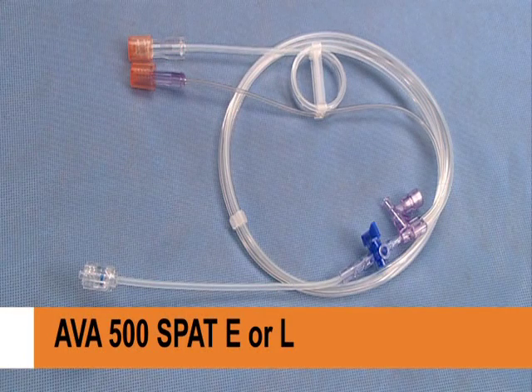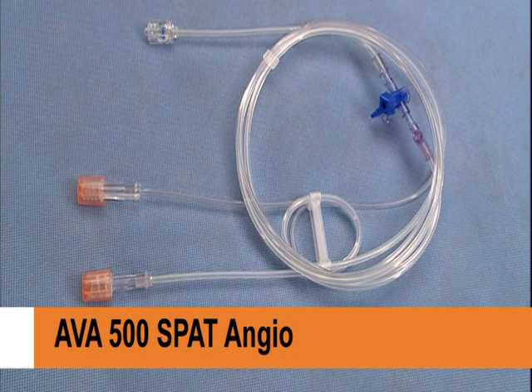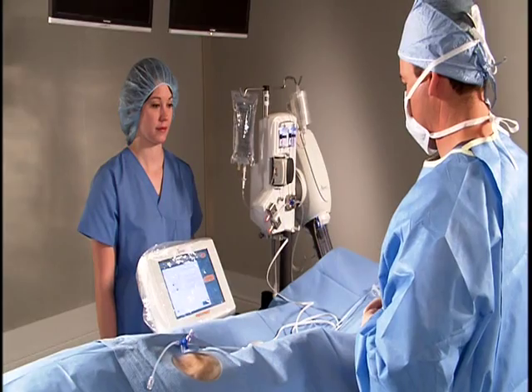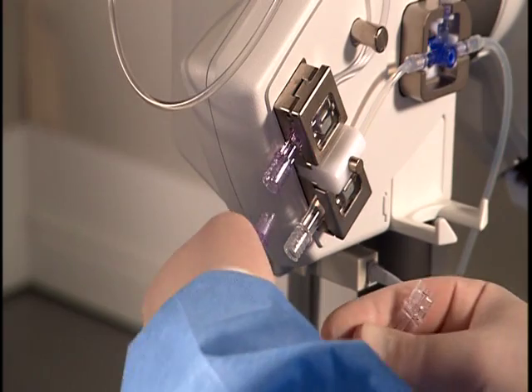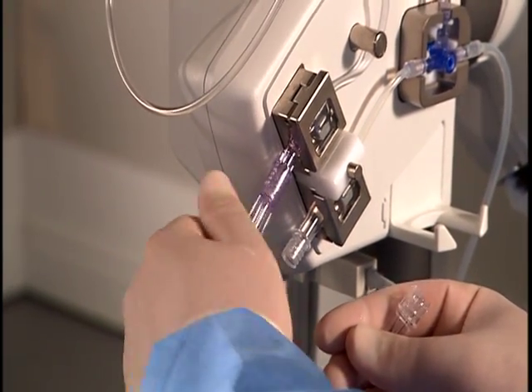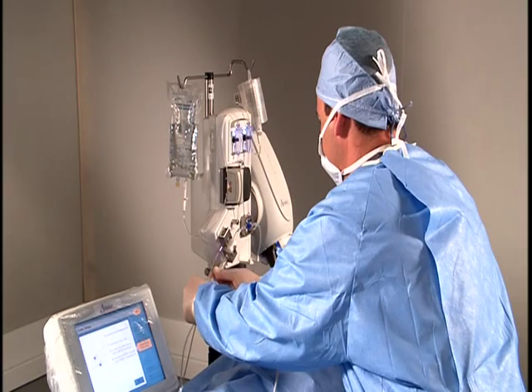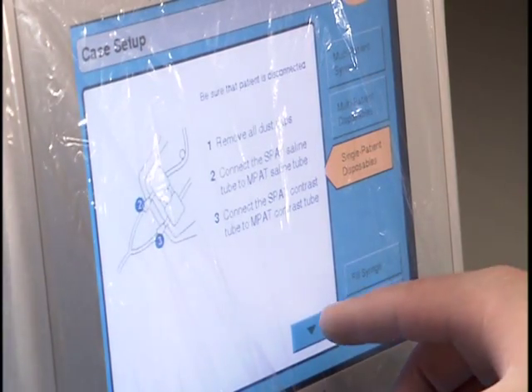The purge process of single-patient disposables AVA500 SPAT-E and AVA500 SPAT-L, which are intended for use with an attachable pressure transducer, differs from the setup of AVA500 SPAT-Angio, which is used without a pressure transducer. To connect any of the SPAT versions to the MPAT, perform the following steps. Remove and discard dust caps from MPAT and SPAT. Connect the SPAT saline tube to the MPAT saline tube. For easier connection, slightly turn the saline luer connector counterclockwise before engaging the connector threads. Next, connect the SPAT contrast tube to the MPAT contrast tube. Then select the down arrow on the touchscreen.